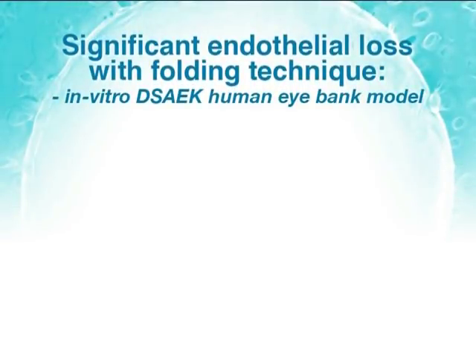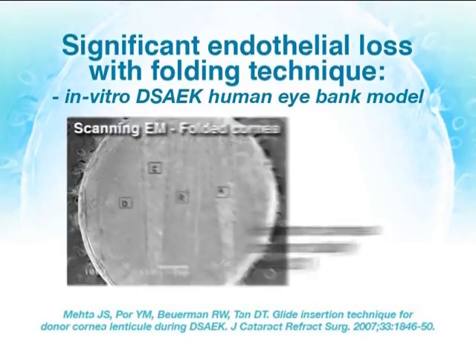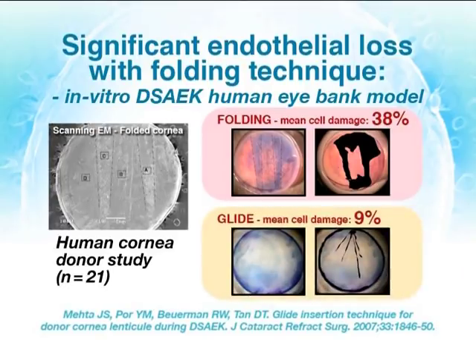Our in vitro studies with human cornea DSAEK buttons using scanning electron microscopy and vital dye staining have now confirmed that folding causes more endothelial damage than our glide technique, relating to forceps compression. Folding resulted in 38% mean cell damage as compared to gliding, which only produced 9% cell damage.